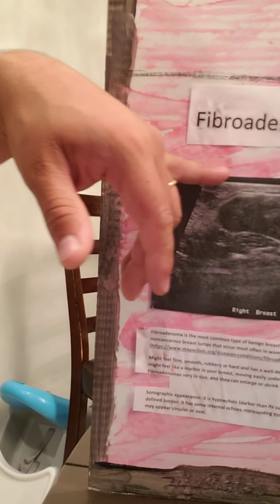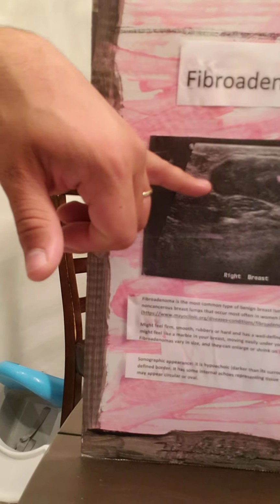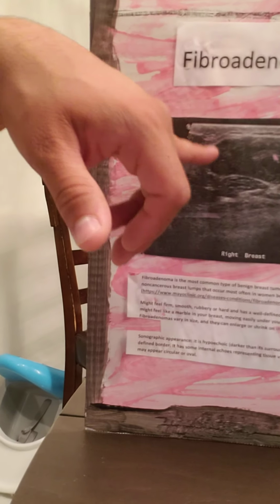fibroadenoma right here. As you can see, remember, this is the top of the image. This is towards the bottom. This right here, this big circle right here, is the fibroadenoma. So a fibroadenoma, basically, it's a tumor. It's not malignant, meaning it doesn't spread to other areas of the body. This is the most common kind of tumor that is found in female breasts.